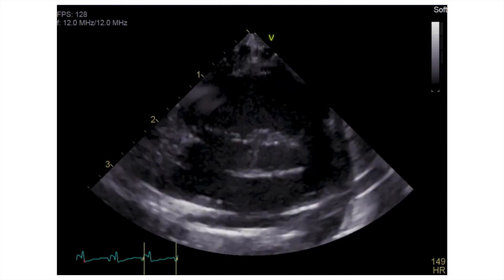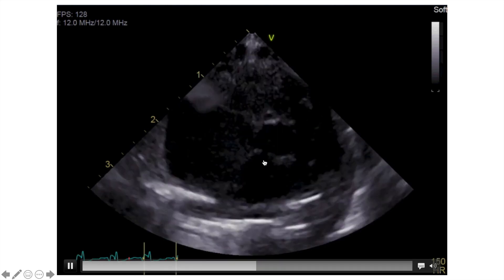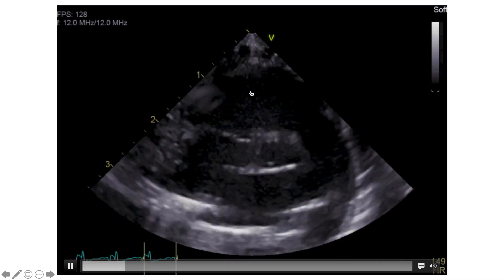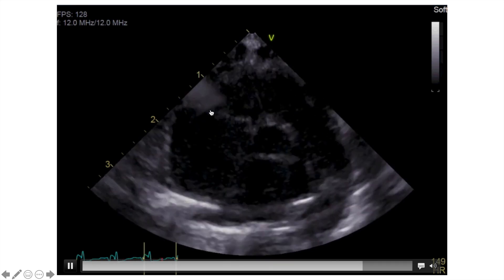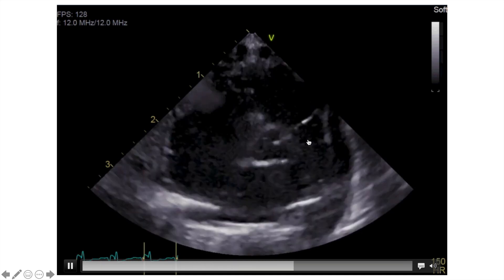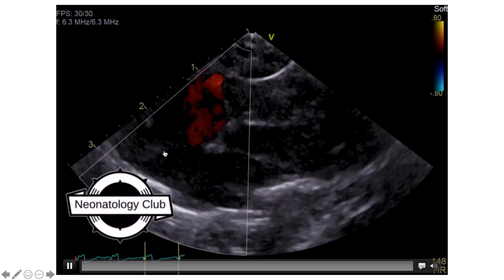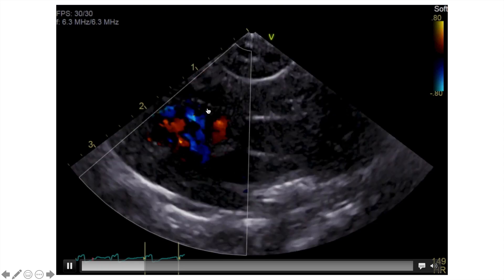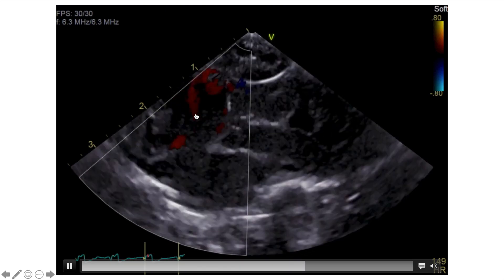We can also see the TR jet from different views. Here we are looking at the parasternal short axis. The aortic valve is in the middle, the right ventricle is on top close to the probe, and this is the right atrium with the tricuspid valve in between. The RVOT and main pulmonary artery are also visible. With color, we see red blood flowing from the right atrium towards the right ventricle, and blue flow representing blood flowing from the right ventricle towards the right atrium — this is the TR jet.